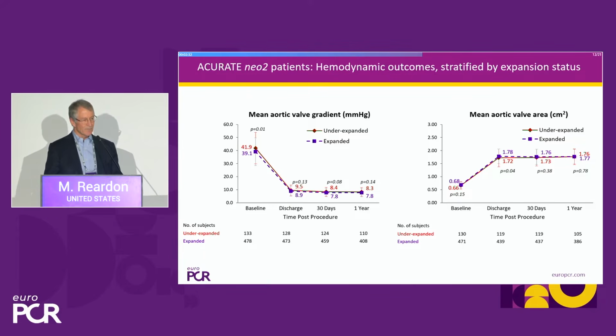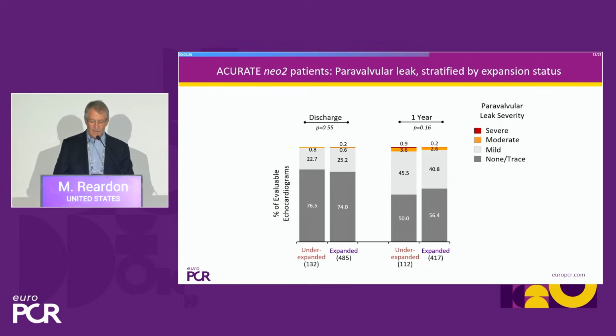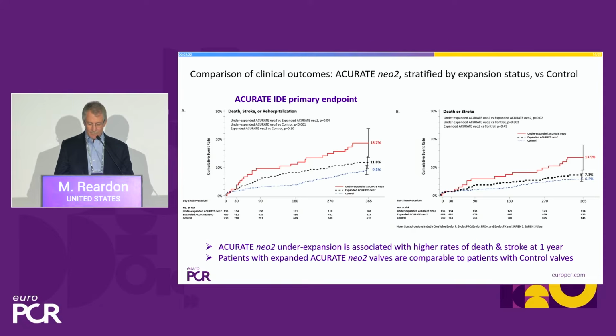Interestingly, we usually post-dilate because of a remaining gradient or PVL, and this was really the same across there, including PVL. No difference in PVL between underexpanded and fully expanded valves. However, if you look at the clinical outcomes, and at the primary endpoint, which was death, stroke, or hospitalization, the red line is the underexpanded valves, the black dotted line is the expanded valves, and the blue line is the control valves.